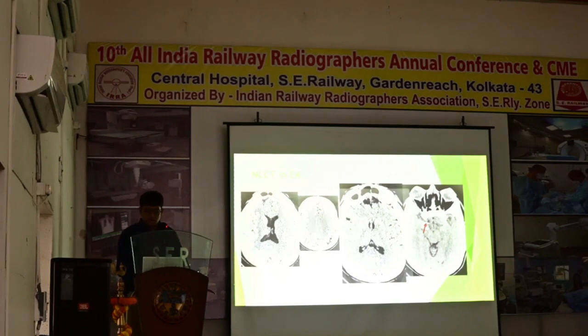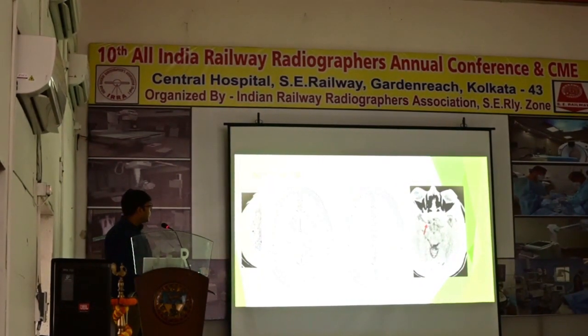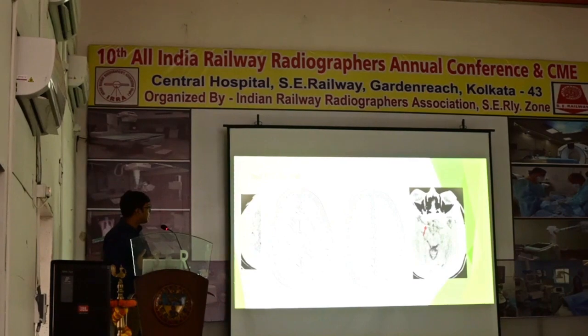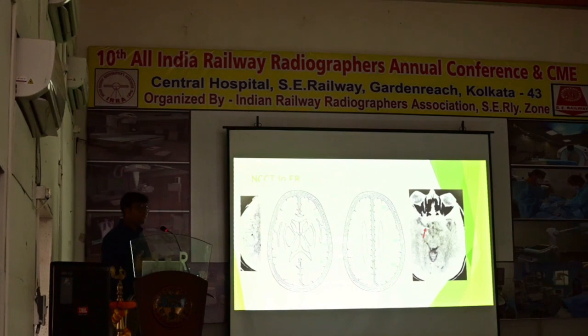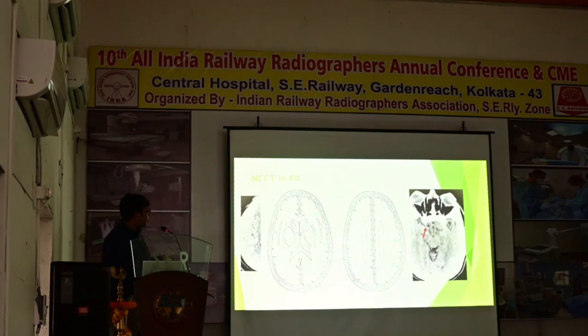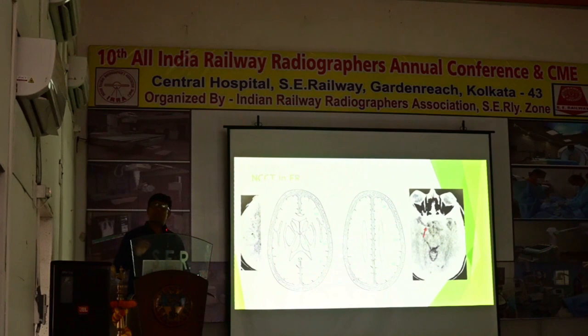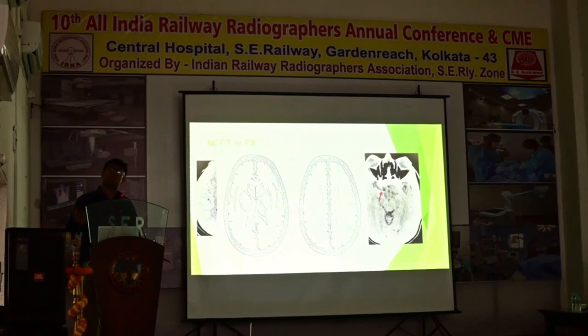Now, in our protocol, we always ask our emergency physicians to get adept with the ASPECTS scoring, which is another radiological scoring. We all know that there is something called the ganglionic level and something called the supraganglionic level, where we have 10 such areas: M1, M2, M3 in the cortex, M4, M5, M6, and caudate, one in the lentiform, one in the internal capsule. So total 10 areas, 1 point each. Every place you have an infarct or an ischemia, you deduct 1 point. The lesser the score, the worse the prognosis, the worse the outcome, and the more chance of a large vessel occlusion.